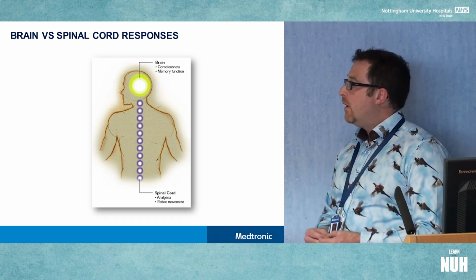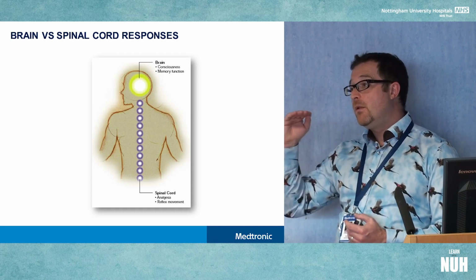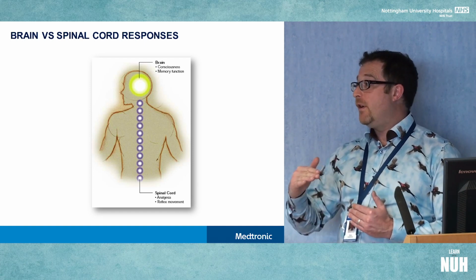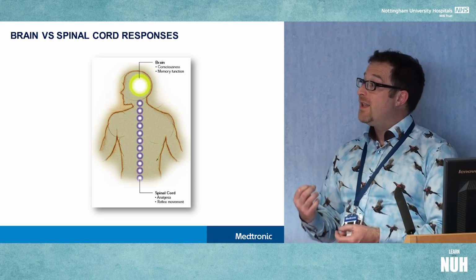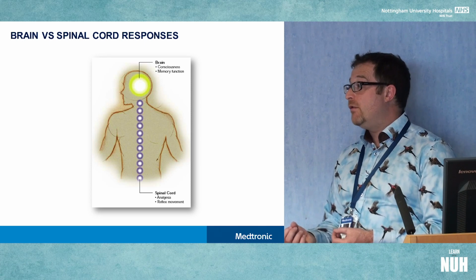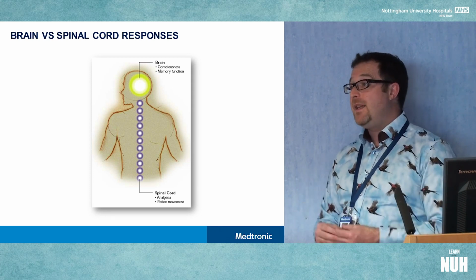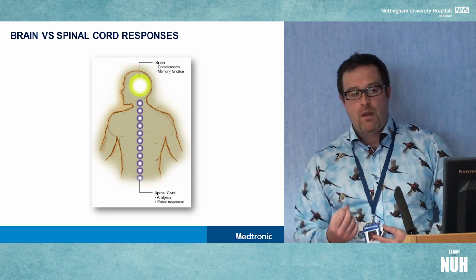What does that mean? What we do know is that below a BIS of 60, the chance of awareness is statistically negligible, and above a BIS of 40, we're avoiding this suppressed activity. In older, sicker patients, the latest 6 RCTs and Cochrane review suggest there's a higher incidence of post-op delirium when you're running these deep states in these higher risk patients. So you're using BIS to titrate.